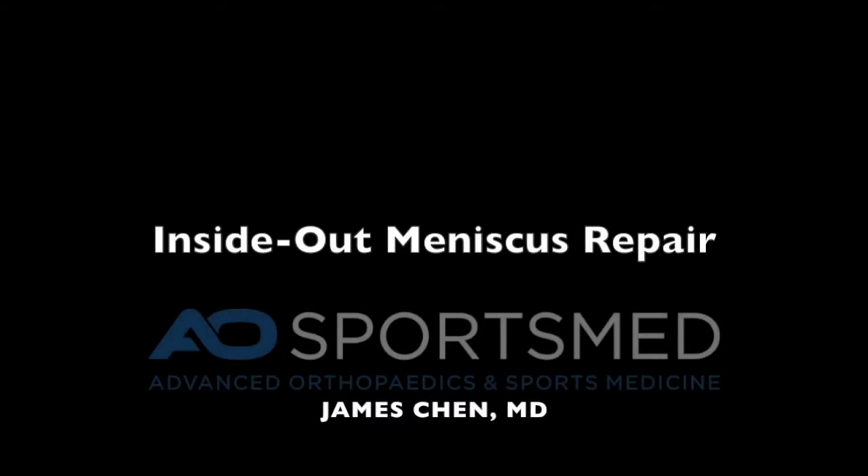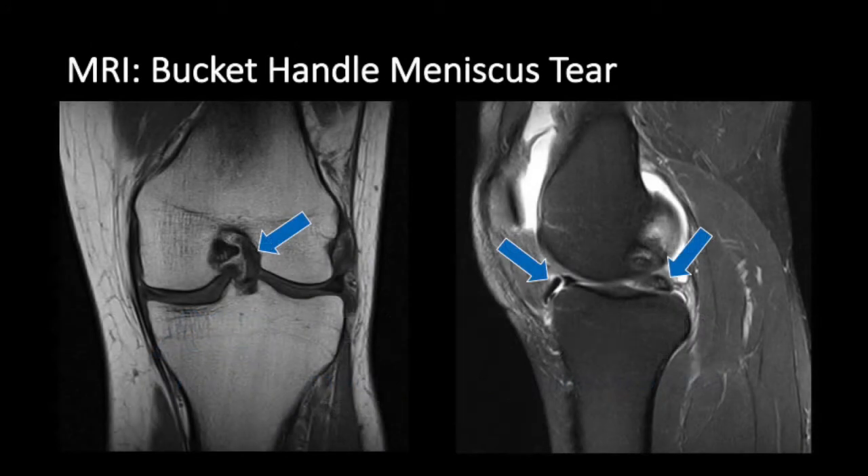This is a surgical video on Inside Out Meniscus Repair. This is an MRI of a bucket handle meniscus tear. You can see on the left side image that there is a flipped bucket handle tear of the meniscus in the notch of the knee, and on the lateral view you can see the bucket handle.